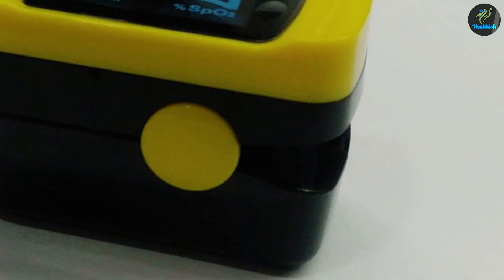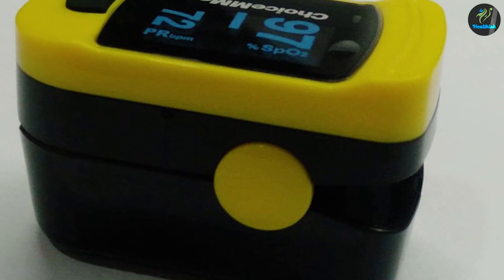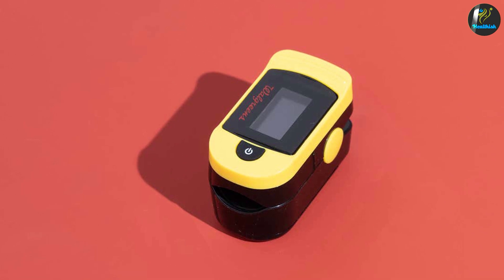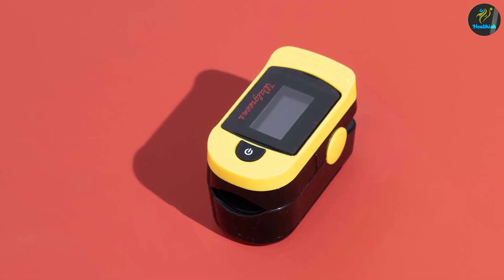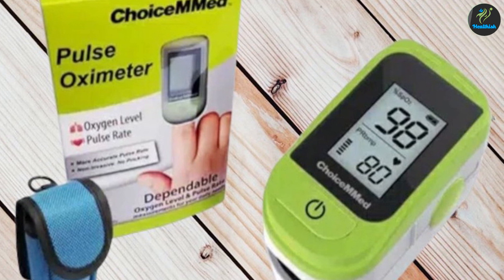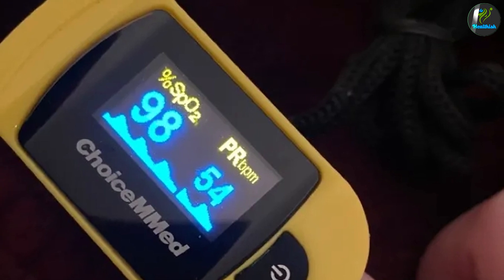The Choice M Med fingertip pulse oximeter is recommended for people with cardiovascular and respiratory issues so that they can perform physical activities in peace. It can also be used to measure stress levels. Pulse oximeters are also commonly seen in intensive care units for infants so that staff can be alerted in case of a drop in oxygen.